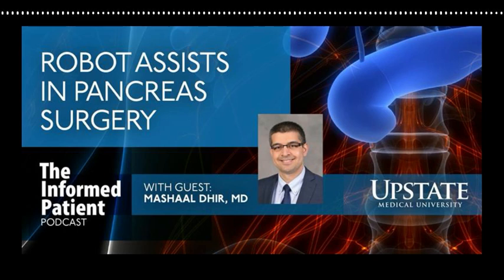So this is a procedure that's one of the most challenging to begin with, but it sounds like it may even be more challenging doing it robotically. Why would you want to do it robotically? What are the benefits? I think it is worth it for the patients. Patients value quicker recovery. If they have smaller incisions, they experience less pain. And I would say patients bounce back quickly.